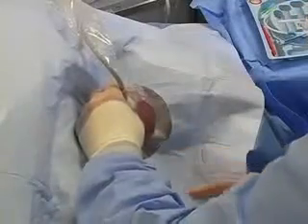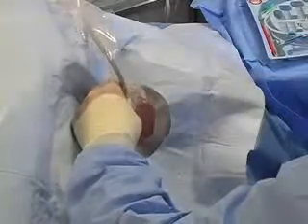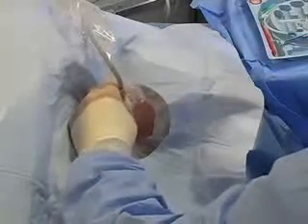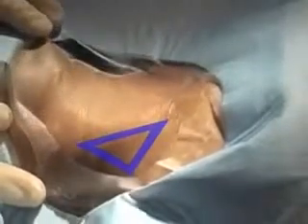During the placement of the line, any assistant or observer should feel empowered to halt the procedure if there is a break in sterile technique. Confirm the needle insertion site again. Generally, it is at the apex of the triangle, just lateral to the carotid pulse.